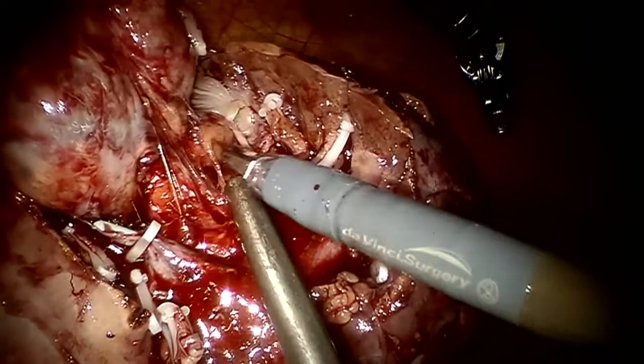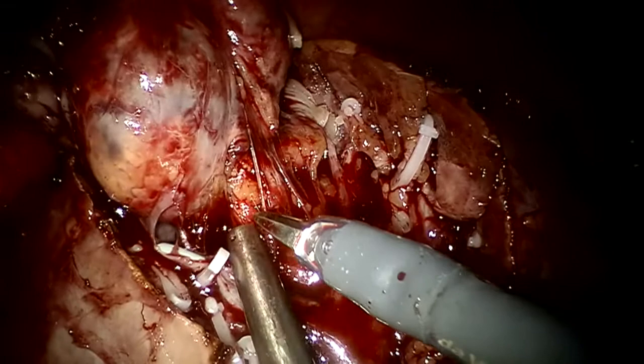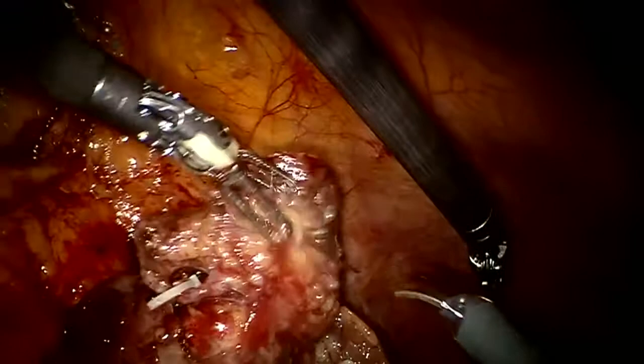And right, this looks fine. So what do you think? This is fat, right? I mean, this is tumor. Yes. That's a little capsular breach. And we will go here. That's the collecting system. Let's do it from that side now.